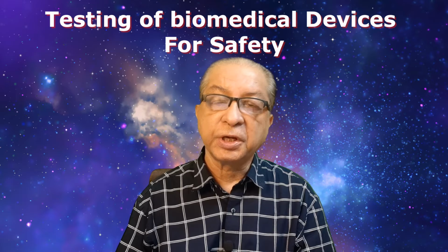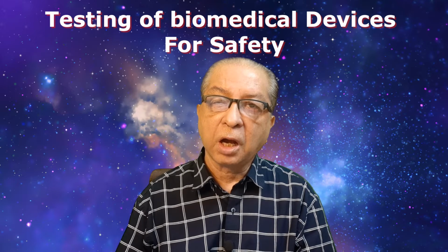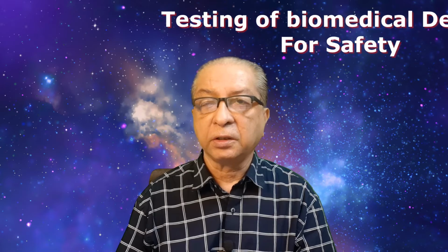Today's topic is testing of biomedical devices for safety. Today we will see how medical devices are tested to make sure they are safe for use. We know now that medical devices are made up of metals, plastics, carbon, natural fibers, or most of the materials that are available in the market today. Device manufacturers are able to procure materials with certificates. That means materials that are certified to be safe for manufacturing or fabricating a medical device.